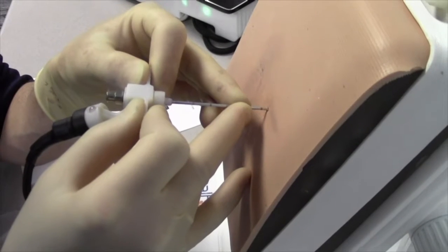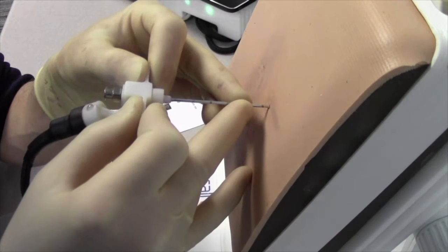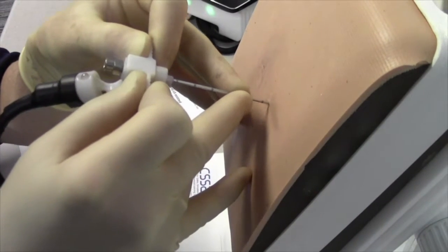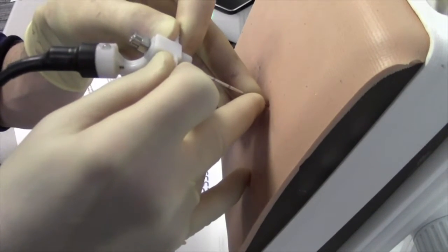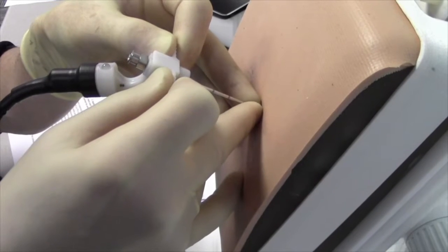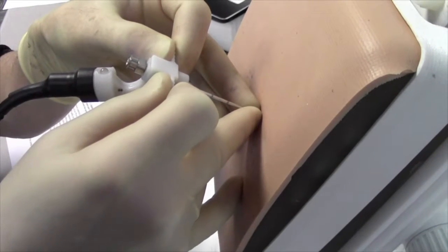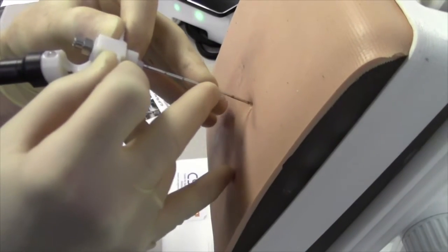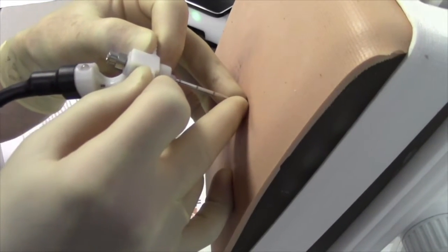When you land on a transverse process, there are two options to proceed. If the patient is relatively small, you can walk off down and then advance. However, if the patient is larger, you cannot do this technique without bending the needle. Therefore, you need to pull back, angulate your needle a little bit, and advance in this way.